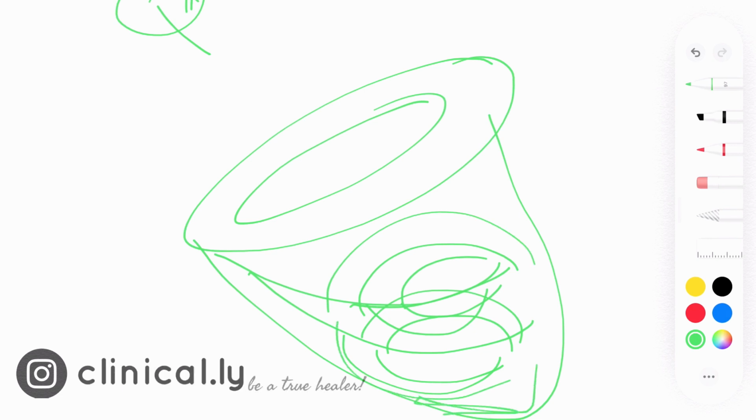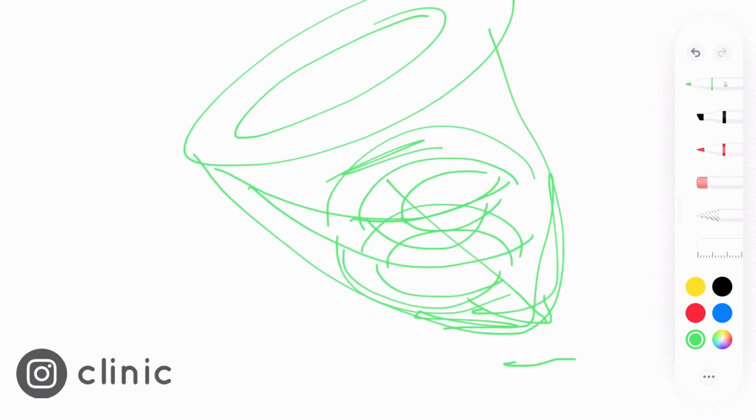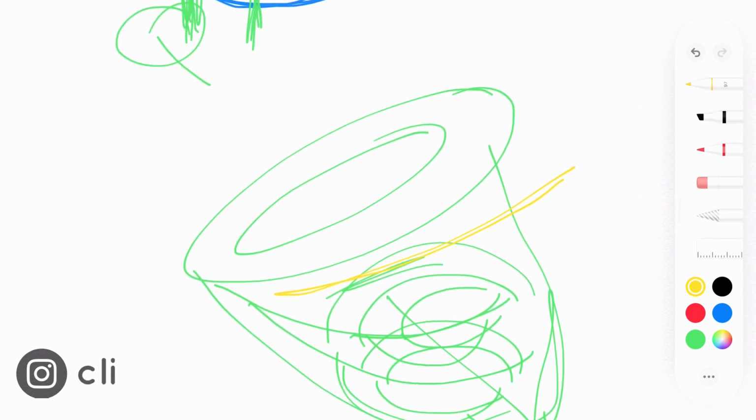So it reaches up to the apex. So from above, downward activation is completed, and this timing is equivalent to the R wave duration.